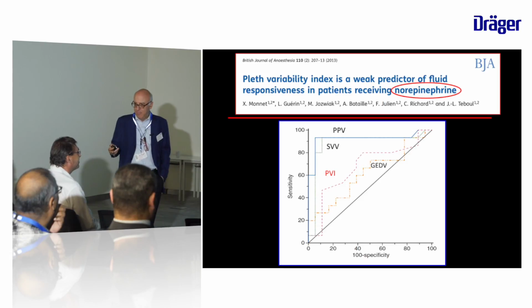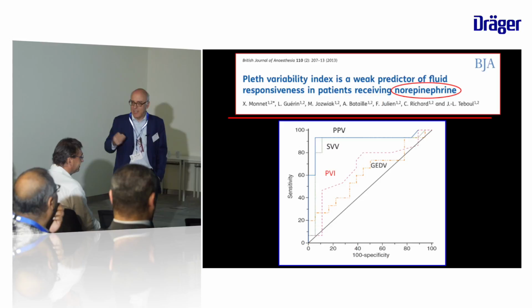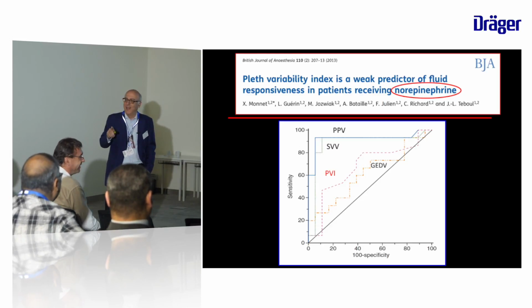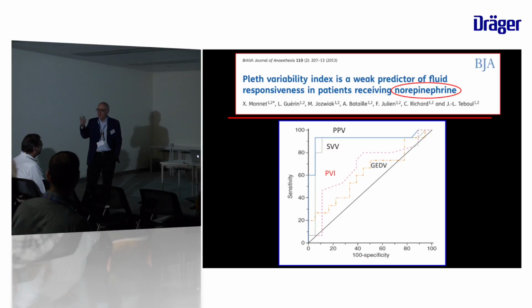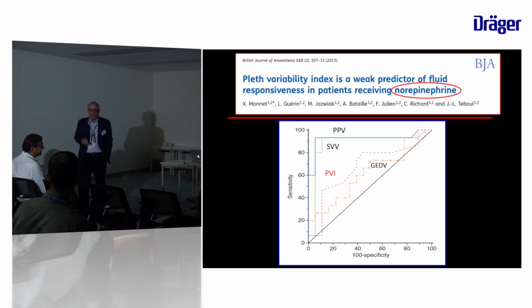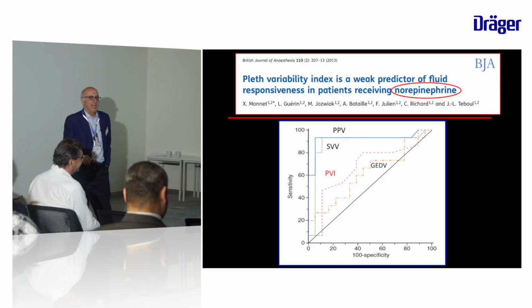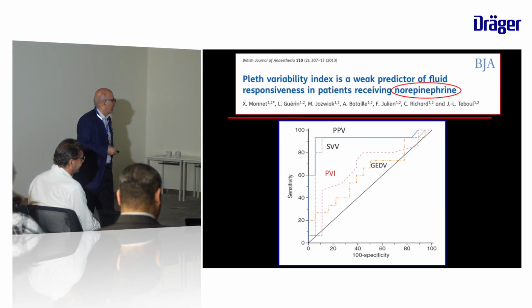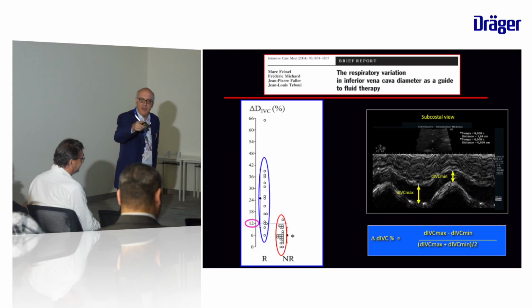In a normal doctor that receives this, it is working, in the patient not. Exactly. Even in the normal doctor, but I don't record this. I tested on myself, I had very funny numbers on cardiac output. But anyway, I don't want to discuss this further, just to show that I don't think these methods should be recommended in general practice.